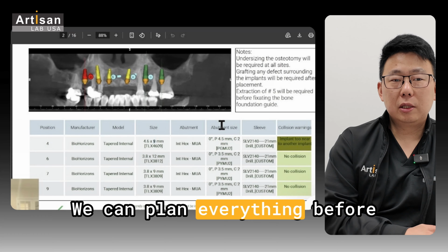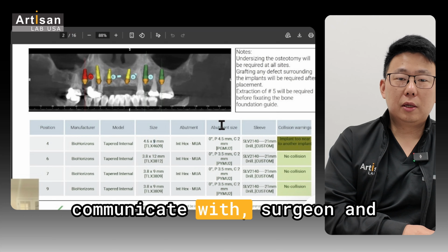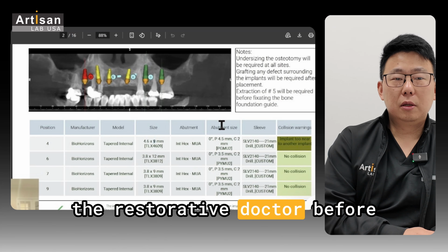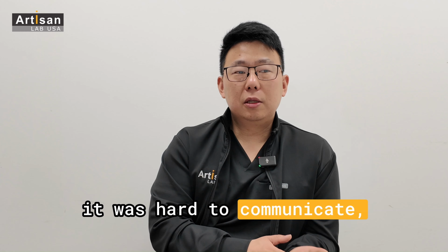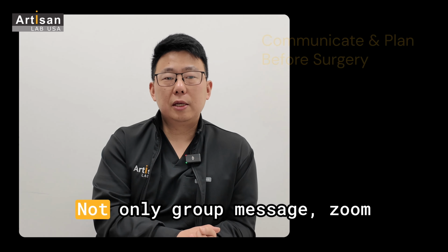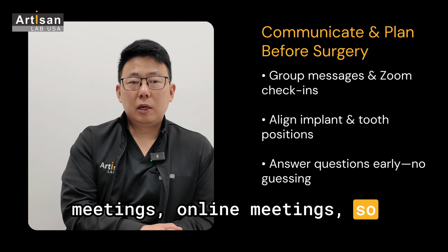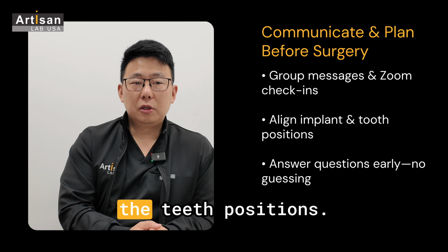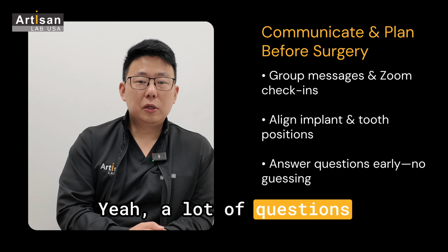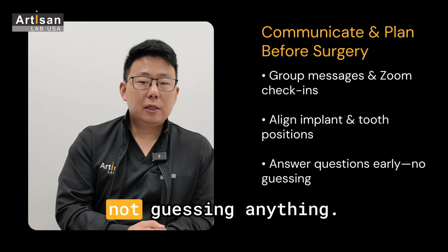We can plan everything before the surgery and communicate with the surgeon and the restorative doctor, because before it was hard to communicate, but now we have many tools, not only group messages, but Zoom and online meetings, so everyone is on the same page about the implant positions and the teeth positions. A lot of questions will be answered before the surgery so that we're not guessing anything.